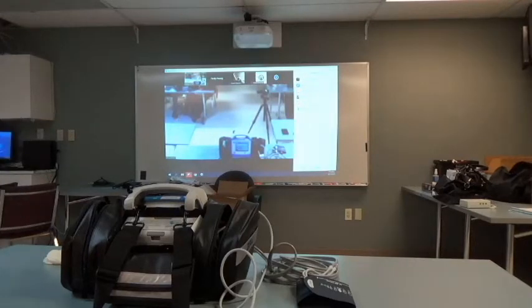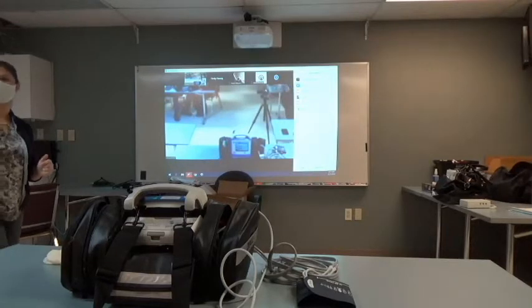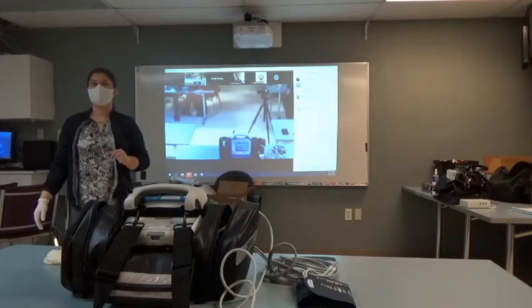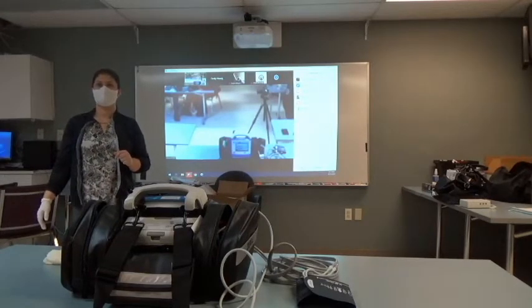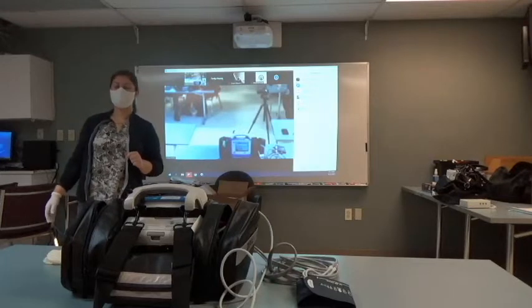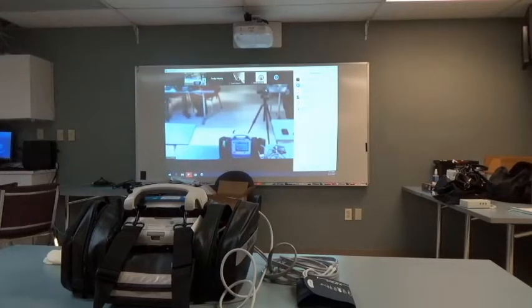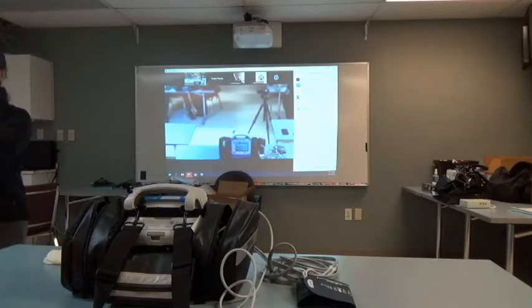Is there a way to have it cycle every 5 minutes after the first one's initiated by the provider? No. I would love that. Our old device did. That is not something this current one does at this time. But if they decide to update that with the ability to upgrade the software via USB, it's something that could be done. I don't know how that process works or if that's even on the radar right now. So yeah.